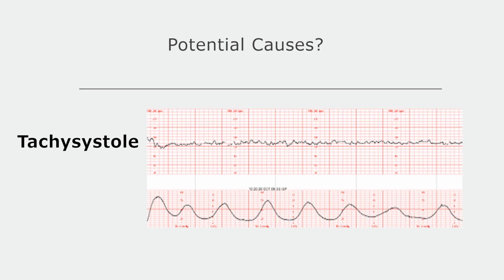That's why you want to intervene. You don't want to just let this go on. Okay, and you'll have providers try to bully you into keeping the Pitocin on. Don't do that. You got to be the advocate as a nurse. So if a patient walks in and they have this kind of pattern, you got to suspect placental abruption, especially if the patient is having a lot of pain. Okay, so this isn't a normal looking pattern.